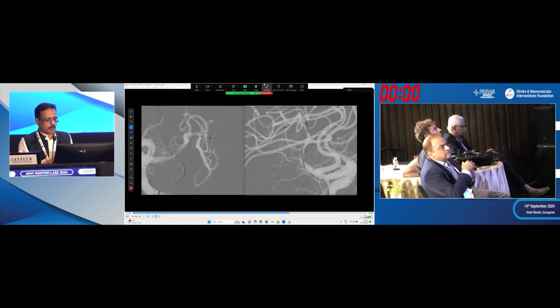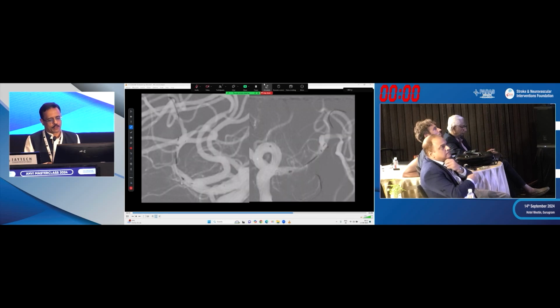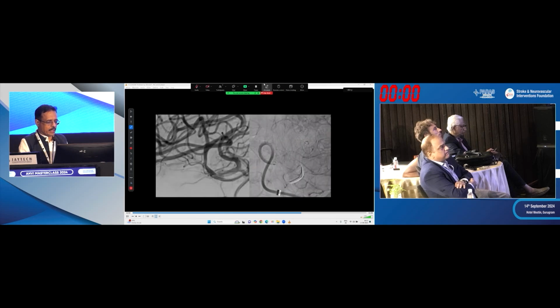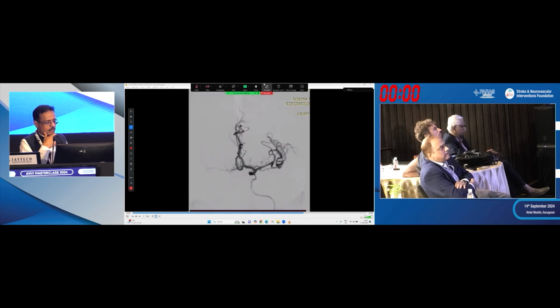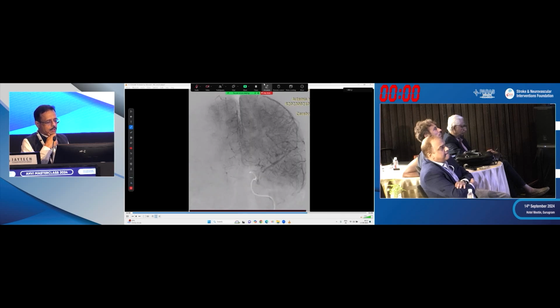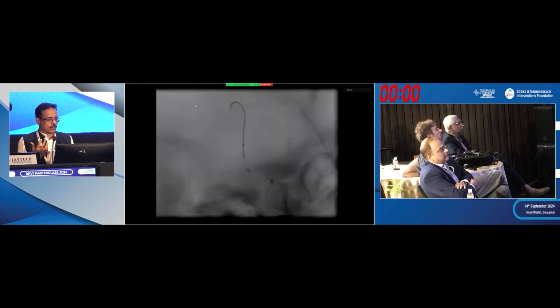We injected antiplatelet agents, and in this case, one can debate between balloon mounted or self-expanding, but we used a Credo stent here. Now, if you can see already, it seems we have placed it quite distally in the ICA. The proximal part wasn't really looking that well open. So initially the flow is now good.